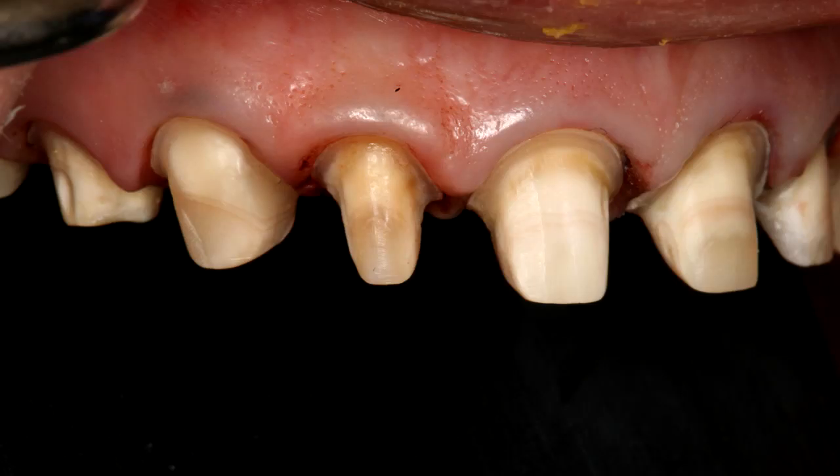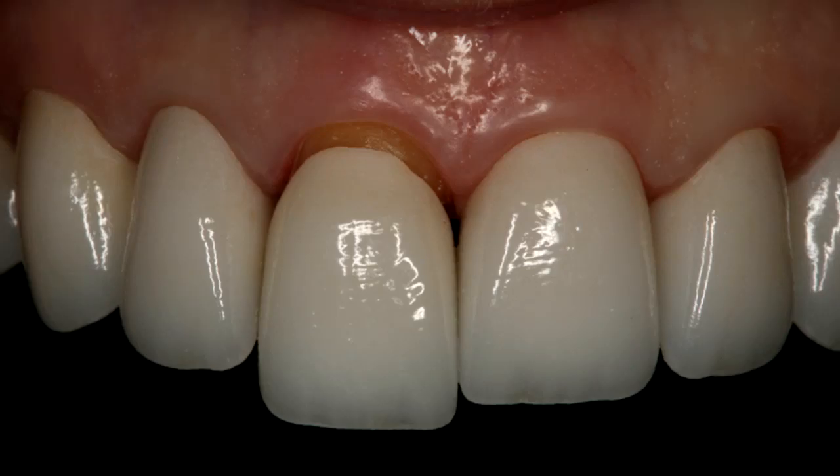Now, for patients with dark teeth we can absolutely block out the darkness using full coverage crowns, either with a metal base restoration or with a more opaque zirconia material. For instance, in this case the patient presented with previous failing PFM crowns to block out the tetracycline-stained teeth. Our treatment solution was to use zirconia with layered porcelain. The zirconia absolutely blocks out the discolorations and allows the technician the opportunity to create bright, aesthetic-appearing crowns. I have the right central incisor crown lifted so you can see the discoloration of the tooth underneath.